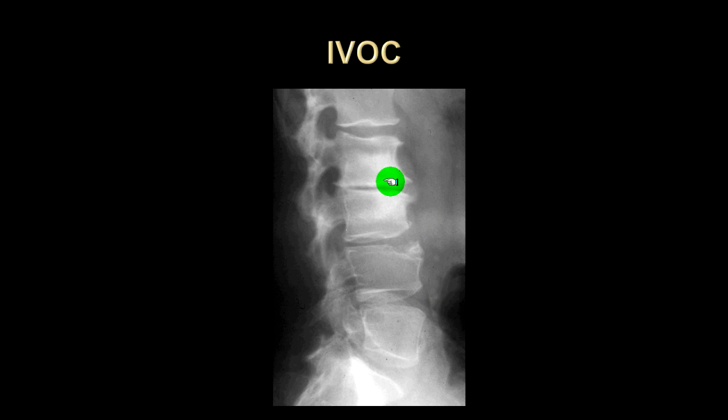So that's our case for today. Intervertebral osteochondrosis at the L2, L3 level, as identified here. A very large Schmorl's node at the L4 level. That's residual from something when this patient was much younger. And calcification within likely the abdominal aorta and definitively within the common iliac vessels.